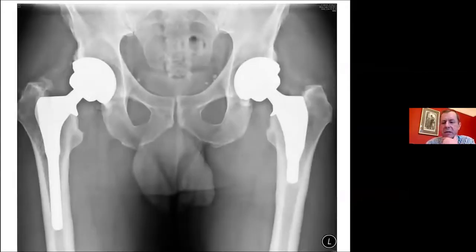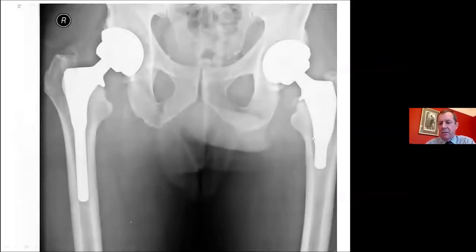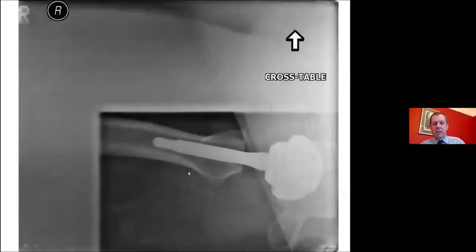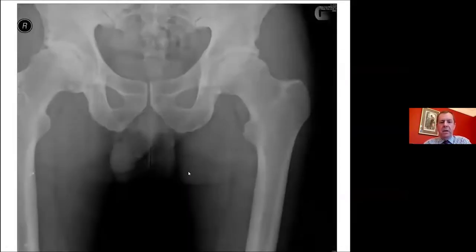And that's an x-ray at a year of osseointegration. If we go back between the two, you see initially the stem is sitting in the hollow bone. And what we see with the Evolution is very good new bone forming around the lower part of the stem where load transfer is occurring. And a view from the side.